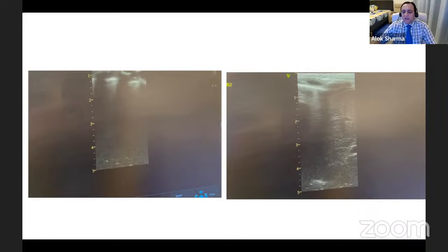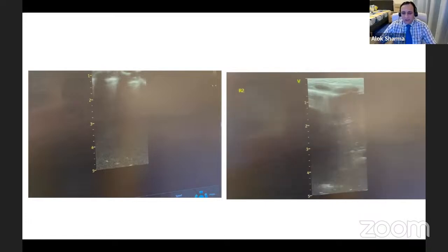If you were using it for an extremely preterm or a preterm baby, I would try to get the frequency up to 11, 12. But for a term baby, a frequency of at least 8 to 9 would probably give you a little bit better image resolution. But these images are beautiful. Oh, thank you. So we can carry on.